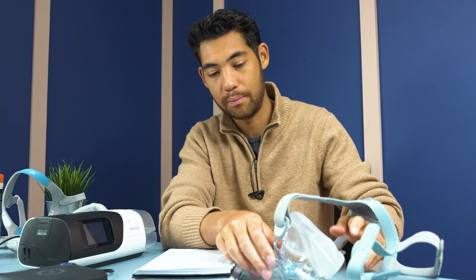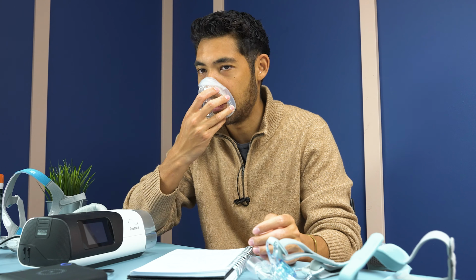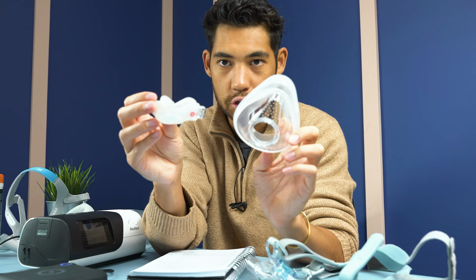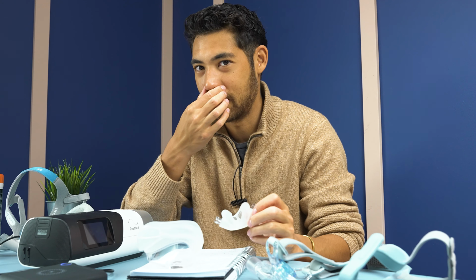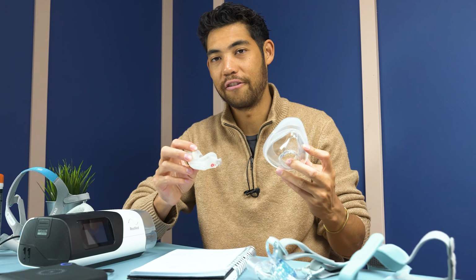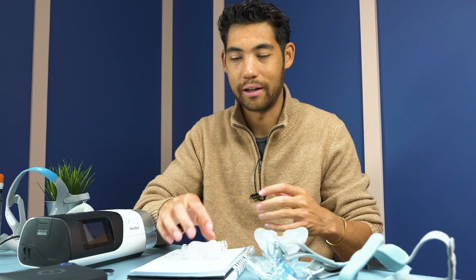Well, when you first start CPAP, you're going to notice a lot of red marks, maybe uncomfortable areas in your face, maybe like a tiny little rash here and there. And that is because you have the moisture and the silicone on your face all night long. It's going to be a little bit uncomfortable for your skin to toughen up. And so if you get two different masks, such as these two cushion designs here, I can put this under my nose and it's good under my nose. And after 1 or 2 days, I'm probably going to get a little soreness, a little red under my nose. And then I can switch to a full face, which doesn't touch the underside of my nose whatsoever. And therefore we recommend having a relief mask, especially if you're starting out, just so your skin doesn't get as irritated when you're starting it and make you want to quit CPAP.